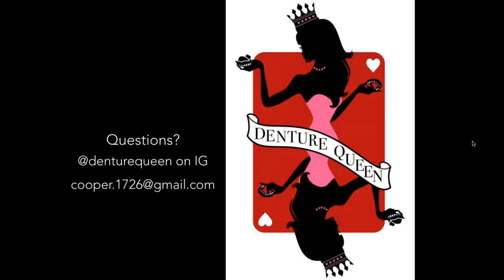Okay, so do I have a lot of debonds with bonded denture teeth? I do not. However, I stopped using bonded denture teeth about 1.5 years into the process because I love the monolithic products, and I've not had a monolithic tooth ever debond because it just can't. So I have not had that particular problem, and I am not sure if other labs have had that problem.